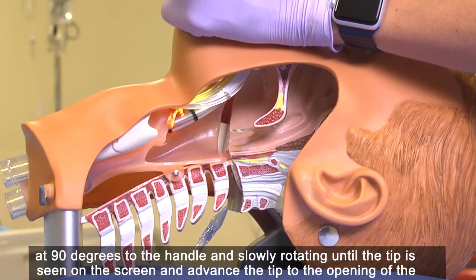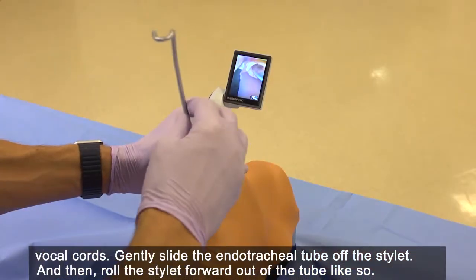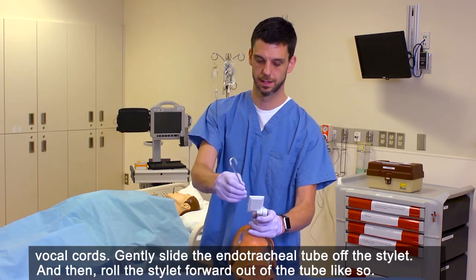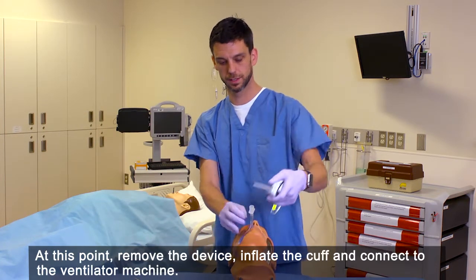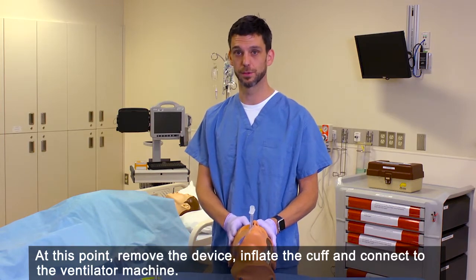Advance the tip to the opening of the vocal cords. Gently slide the endotracheal tube off the stylet and then roll the stylet forward out of the tube. At this point, remove the device, inflate the cuff, and connect to the ventilator machine.